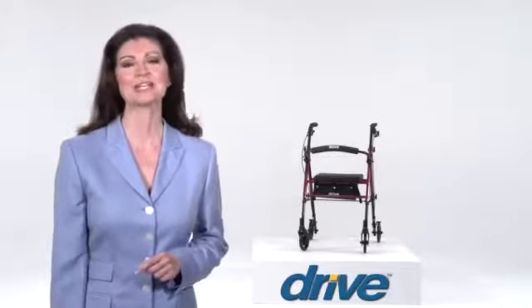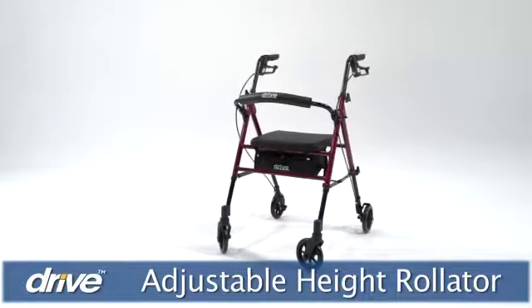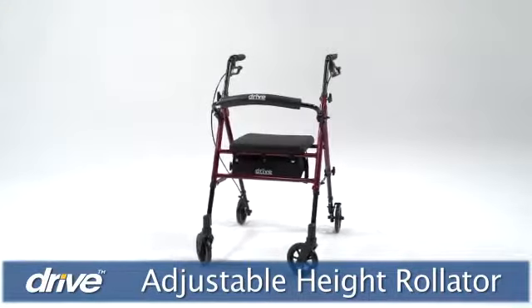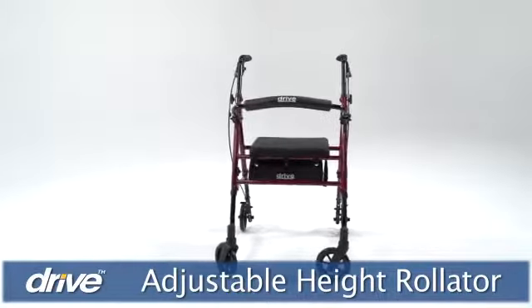Recovering after a surgery or fall, or living with balance issues, can make walking difficult, even intimidating. Drive Medical's Adjustable Height Rollator can provide users of any height up to 300 pounds with much-needed support, mobility, and confidence. It can also be used indoors or outdoors.